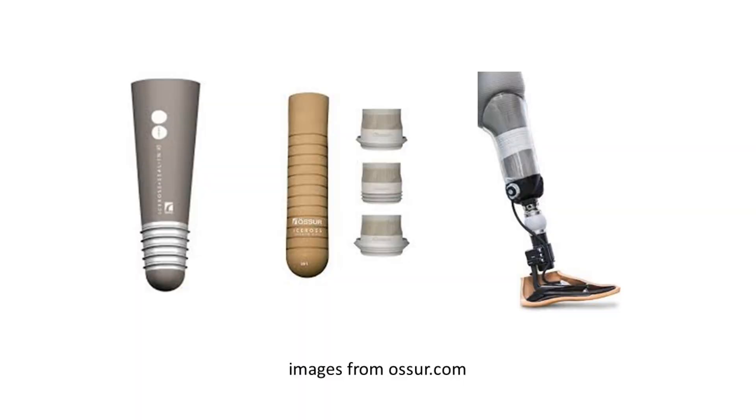Some manufacturers have created systems with seals on the liner that are intended to seal inside the socket. These are referred to as seal-in systems and they do not require a suspension sleeve. These systems work best for medium to long limbs which are cylindrically shaped. However, if the valve becomes clogged or volume of the limb is lost and the seal loses contact with the socket, the prosthesis can unexpectedly become unattached from the body. For these reasons, and because the range of patients for which these systems work is not as large as traditional suspension sleeve suction, they are not discussed here. If one of these systems is right for you, your prosthetic clinician will educate you on the particulars of that system.